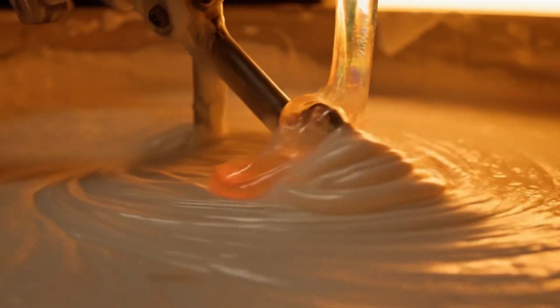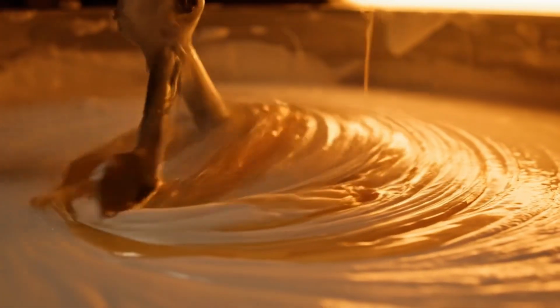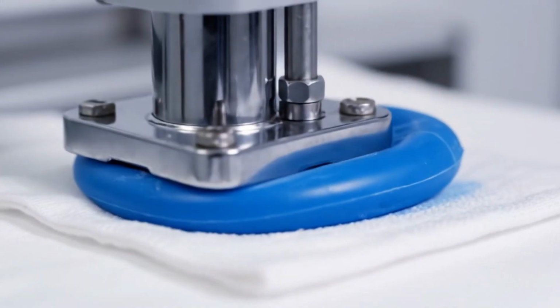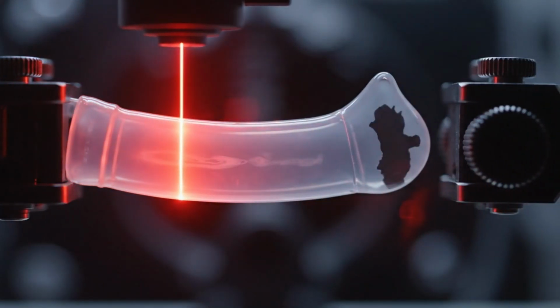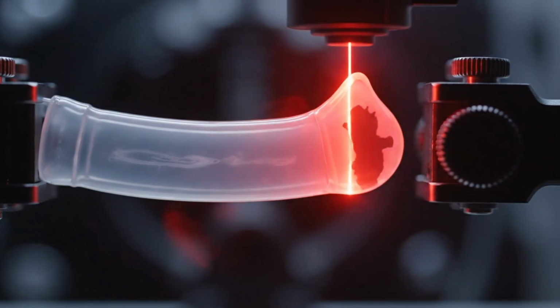Chemical innovation allows us to create sensations of heat or cold, enhancing the product's functional appeal. Safety means no chemical transfer. Our colors are locked in at the molecular level. Engineering the thickness gradient is the secret to a condom that feels like nothing at all, but protects like steel.